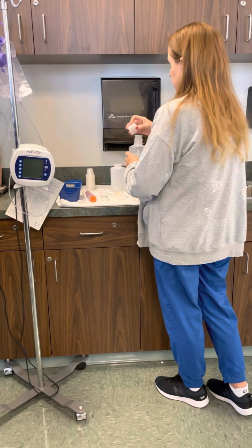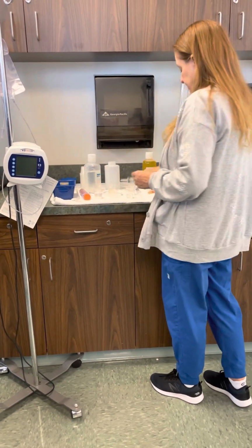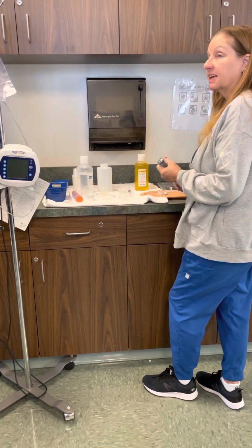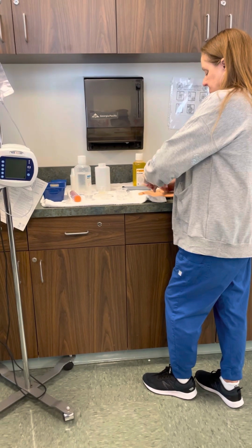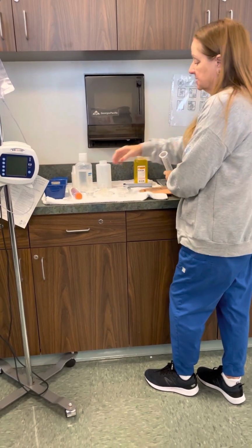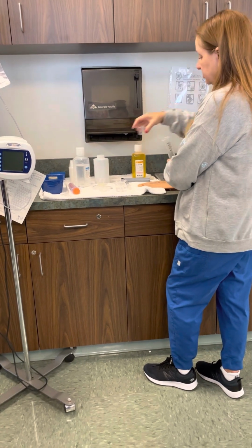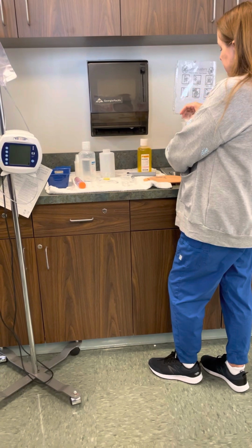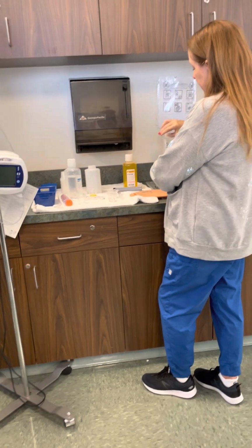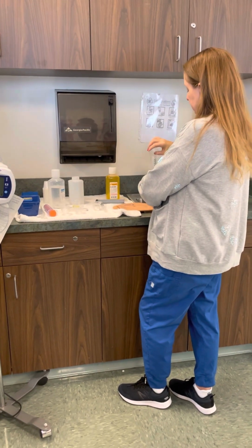Okay? So I've checked placement, I've checked my pH. So what I'm going to do next is give my medications. The first thing I'm going to do is give my flush to flush the tube. And then my next one is going to be my medication. Then I'm going to flush that with water.